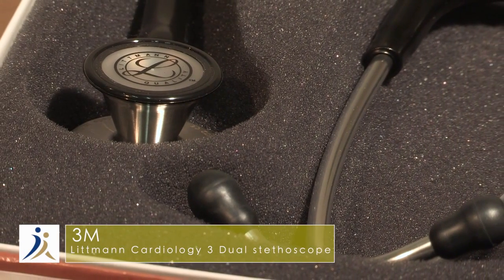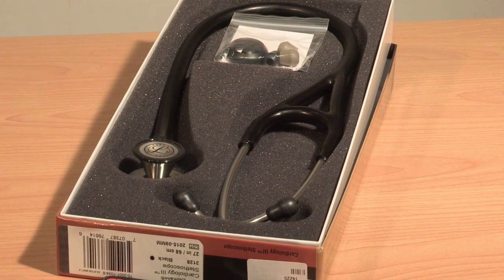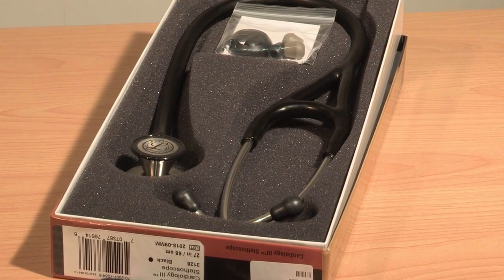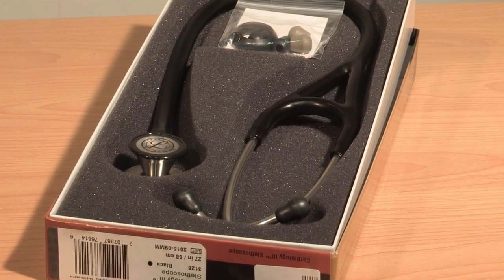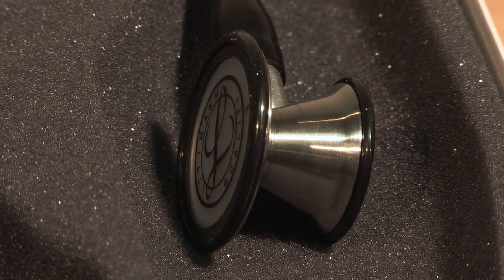Demonstrating the Littmann Cardiology III dual-sided stethoscope from 3M. This stethoscope features a patented tunable diaphragm, allowing both low and high frequency sounds to be heard with either side of the stainless steel chest piece.